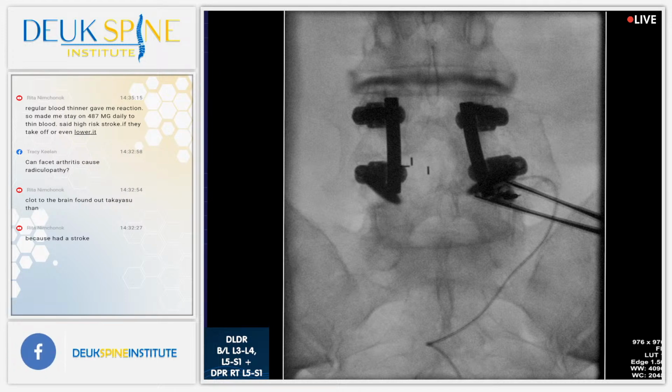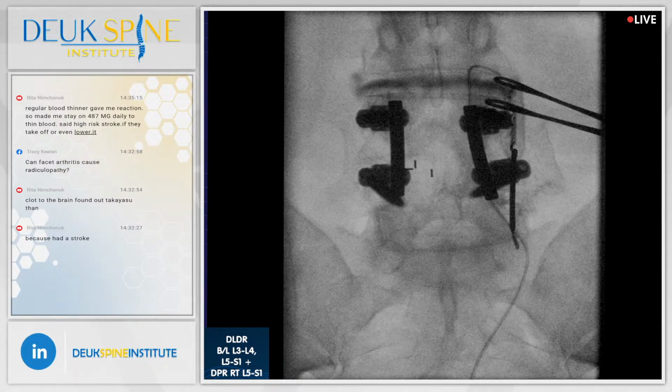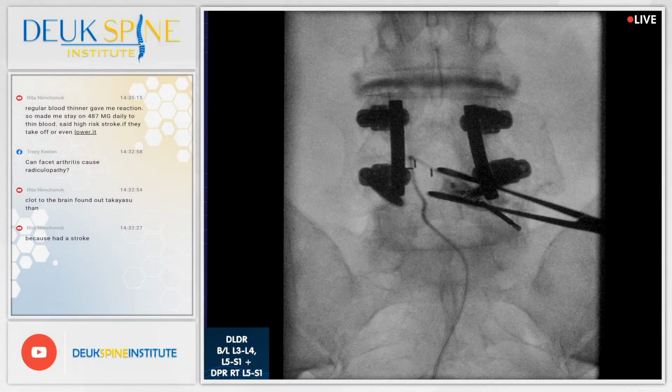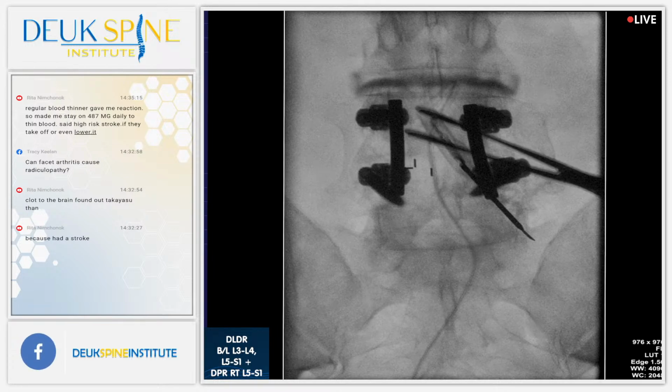All right. We're going to redirect and go a little bit south. Shot. Too far south. South means towards the feet, in case you're wondering. Shot. Not far enough north. Shot. It's getting much better. You can see we're very close to where we want to be. Shot.